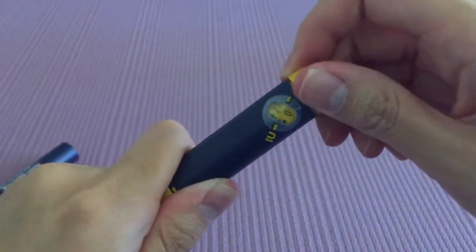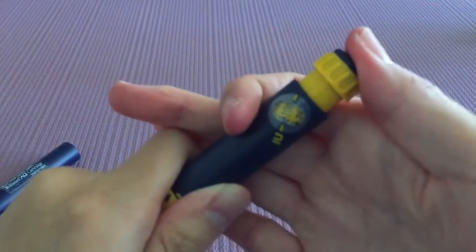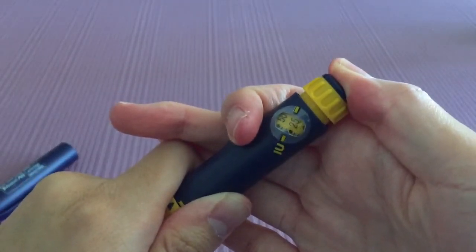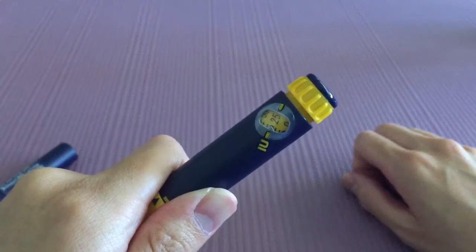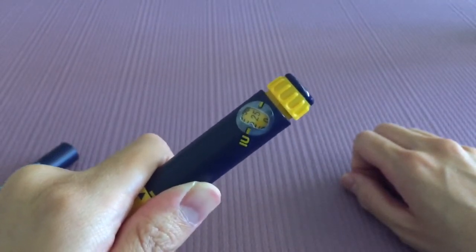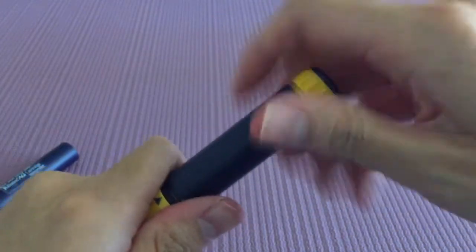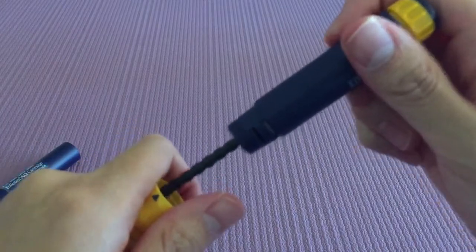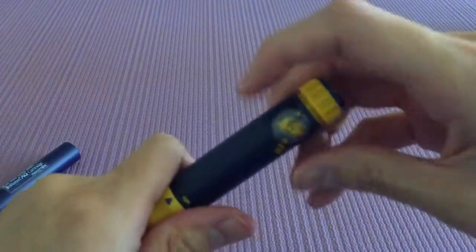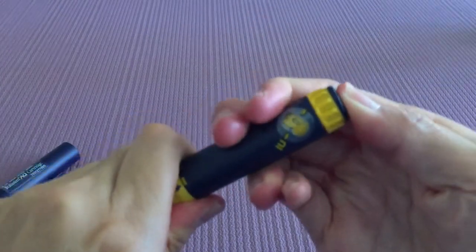Sometimes, if your dosage was 100 and it stops at, let's say, 25, that means you still have 25 international units to go. All you need to do is unscrew this, pop in a brand new cartridge, put it back, and then apply the rest.